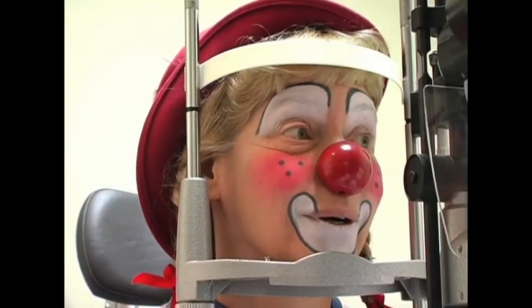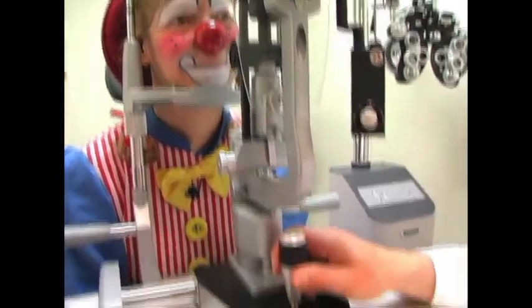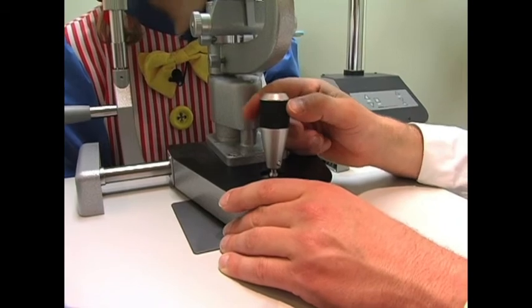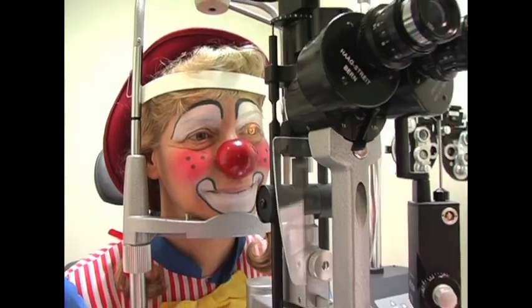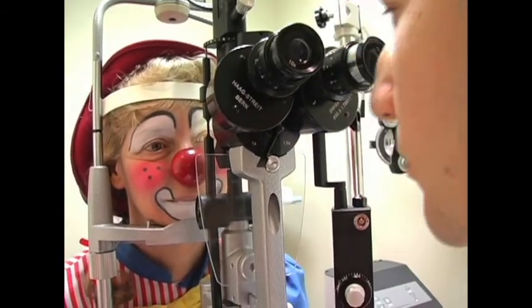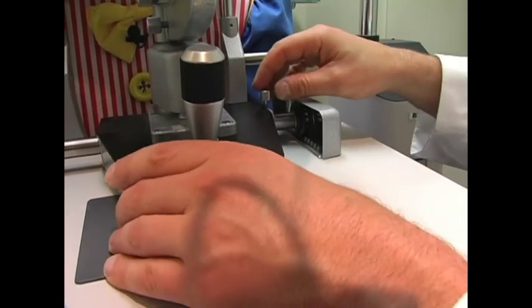Finally, if you're still unable to get a light source, you need to check the light bulb, which is housed in the upper chamber. Another common problem is difficulty focusing on the patient's eye. Remember, with the Haag-Streit slit lamp, you focus by moving the entire slit lamp towards or away from the eye. The light needs to shine on the patient's eye. Check to be sure that the patient's forehead is against the forehead strap. Then move the light source and microscope all the way to the back of the table. As you move forward, the eye should come into view. If the slit lamp is locked, you will have to loosen the screw on the right side of the table to move it. When you are finished, lock the apparatus to prevent damage to the microscope.